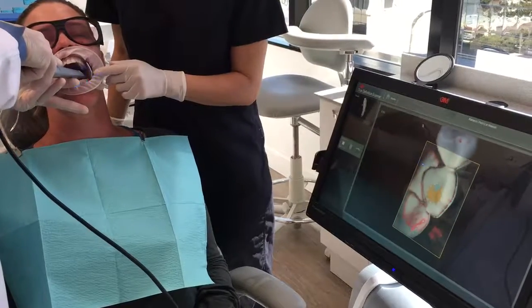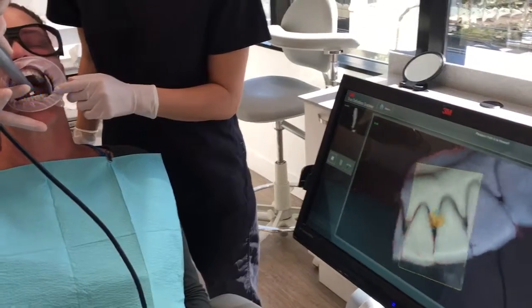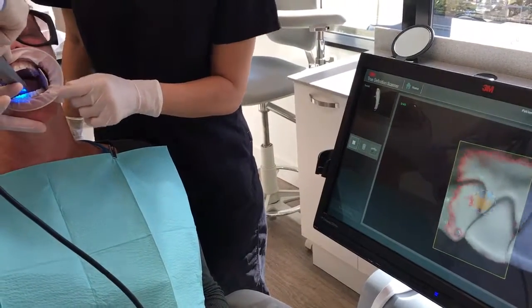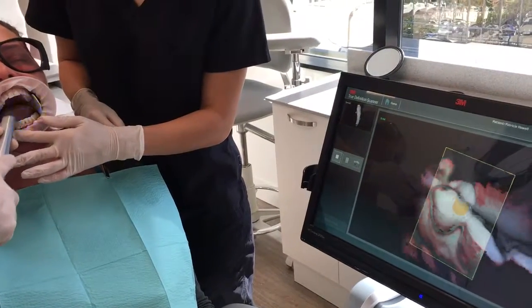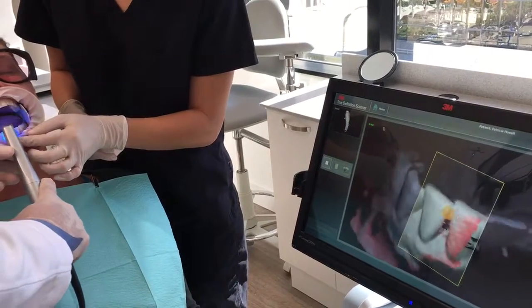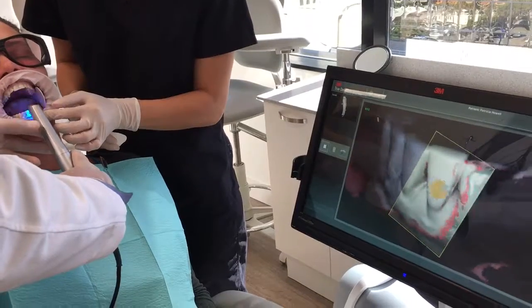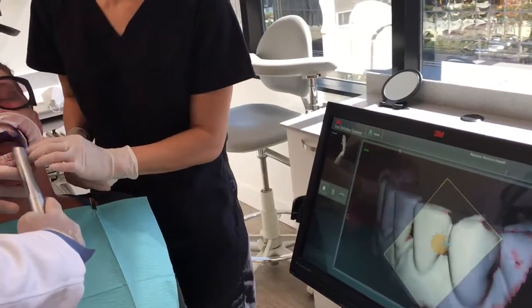We're going to go ahead and patch on a little bit of what we've already captured and start scanning the lower anterior teeth. I don't have a dry angle in this right now. If the patient can keep their tongue away — which she can — sometimes it's better to take the dry angles out that are on the lingual, because they do tend to come into view and then the scan just isn't as crisp.